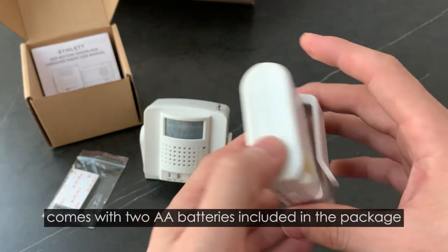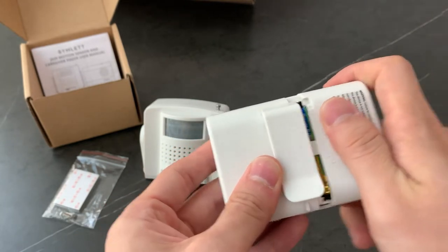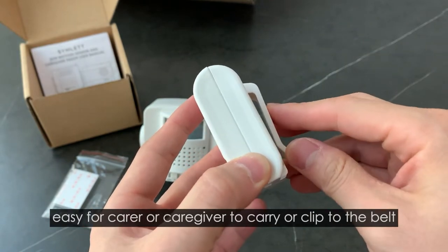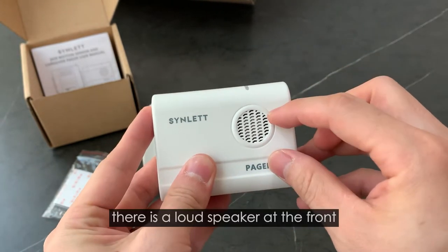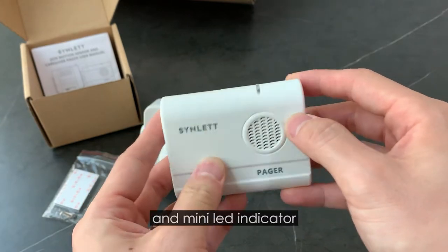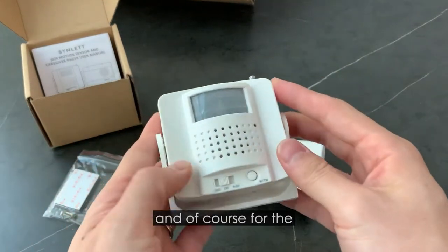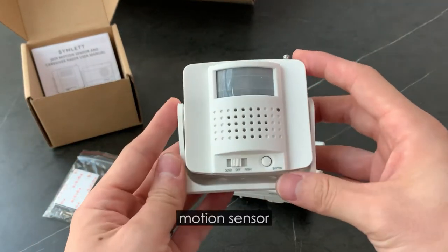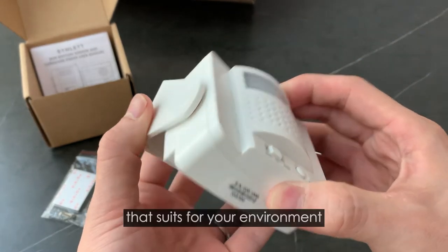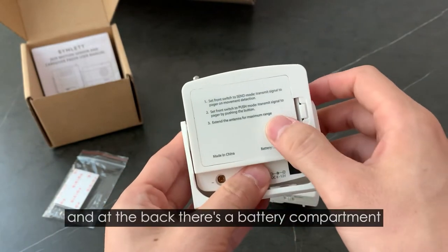The Pager Kit comes with two AA batteries, all included in the package, and you can see there's a belt clip at the back, easy for a carer or KKV to carry or clip to the belt. There's a loud speaker at the front and mini LED indicators. For the motion sensor, you can rotate it at different angles to suit your environment, and at the back there's a battery compartment.